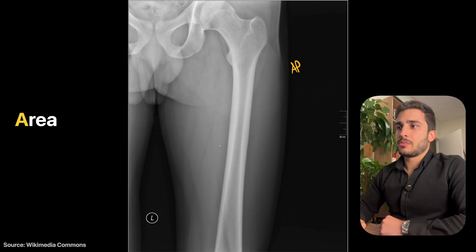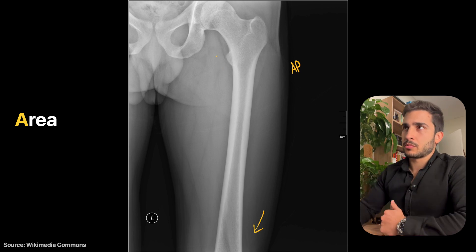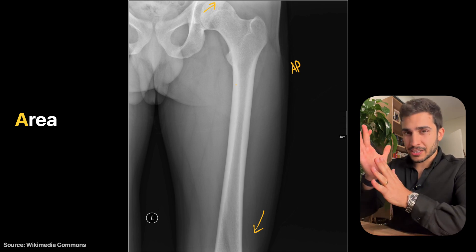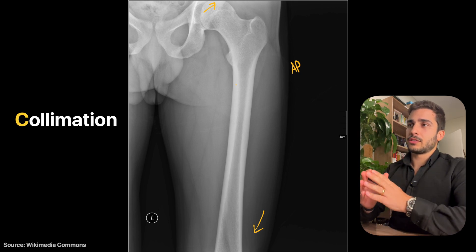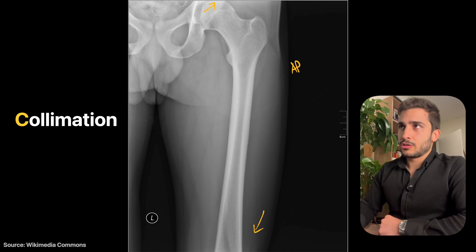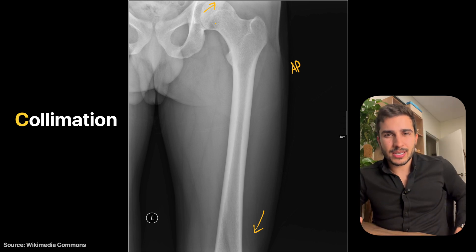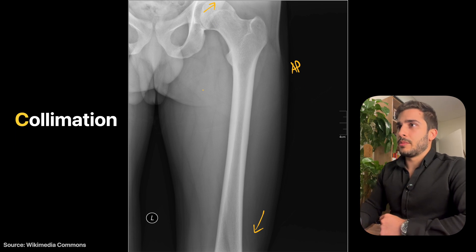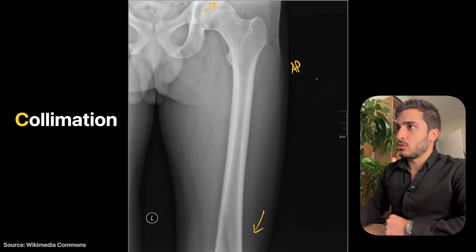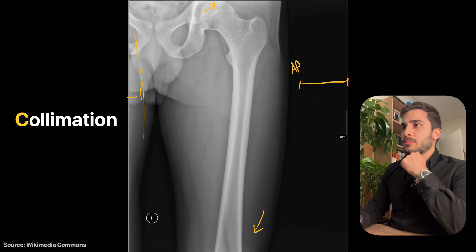In terms of area, because this is a hip-down view you won't see the knee joint. But you should see the hip joint properly — and here you're just cutting it off slightly at the top. Ideally you'd shift the centering up a little. You want at least from the ASIS — anterior superior iliac spine — and down. Top-to-bottom coverage is mostly good, but side-to-side collimation could be improved as there's unnecessary area on both sides.